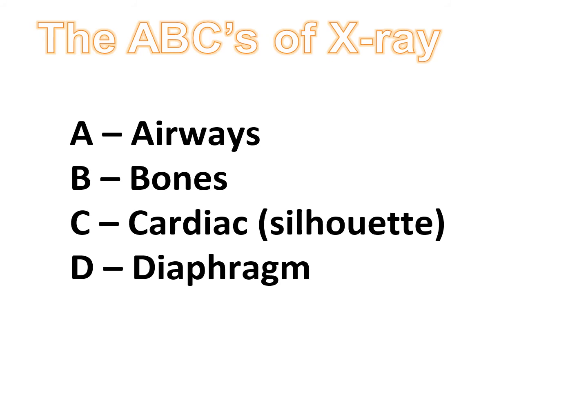So looking at the X-ray from left to right, the heart should not take up more than half of that area. It would be less than 60% on AP films. If your X-ray shows the heart looking larger or the cloudiness looking larger, that could indicate cardiomegaly or CHF.